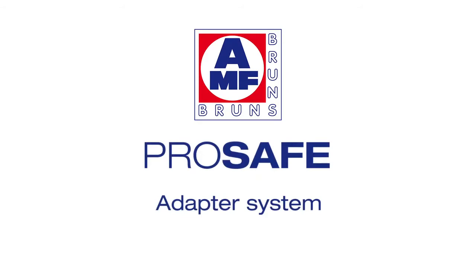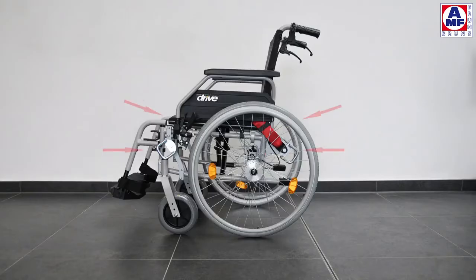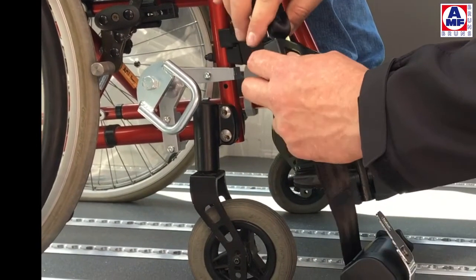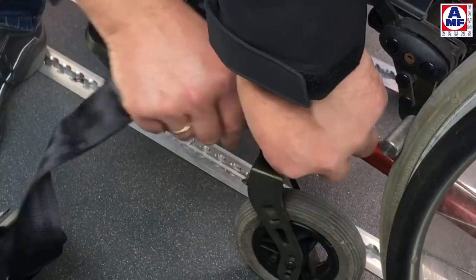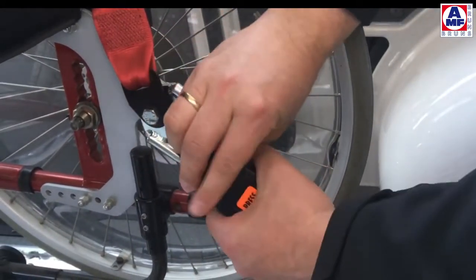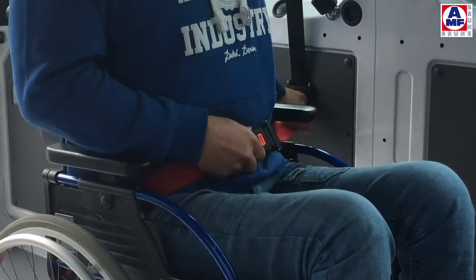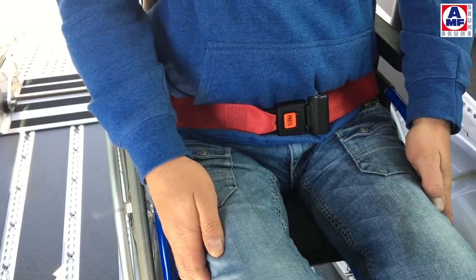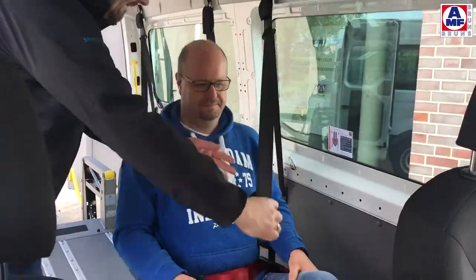ProSafe is a defined connection to the wheelchair. With ProSafe, the tie-down points to the wheelchair and the belts for the occupants are fixed. ProSafe is the consequence of developing the Protector System and can be combined with all standard Protector Systems from AMF Bruns. With only four clicks, the wheelchair is fixed easily, quickly, and without problems — it is impossible to use incorrectly. The pelvis belt belongs to the adapter and can be fitted anatomically correctly. The pelvis belt geometry avoids submarining and is automatically in the correct position. The shoulder belt is connected to the pelvis belt and easy to access. The jackknife effect is avoided.